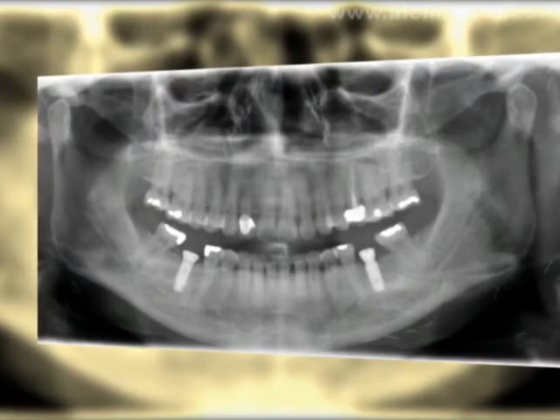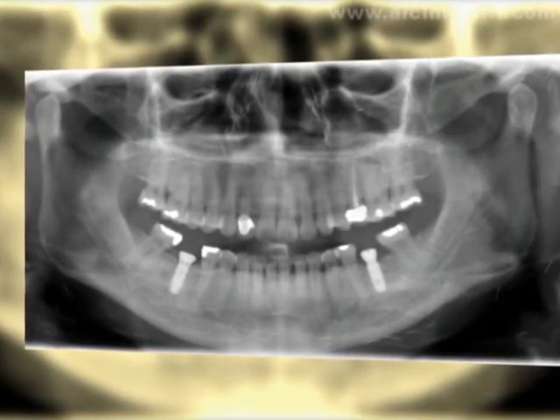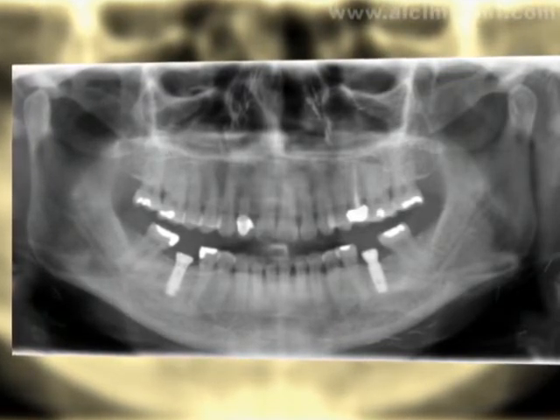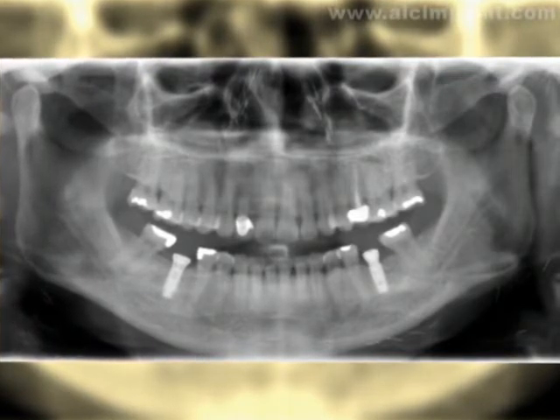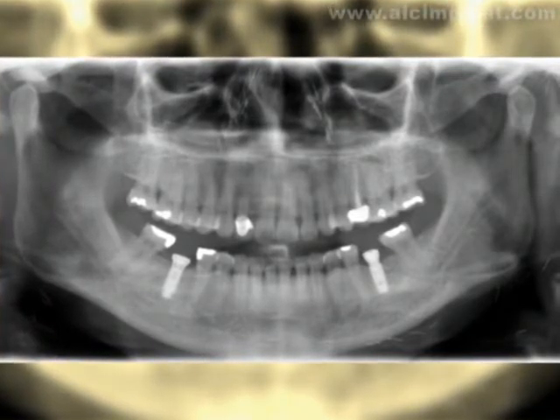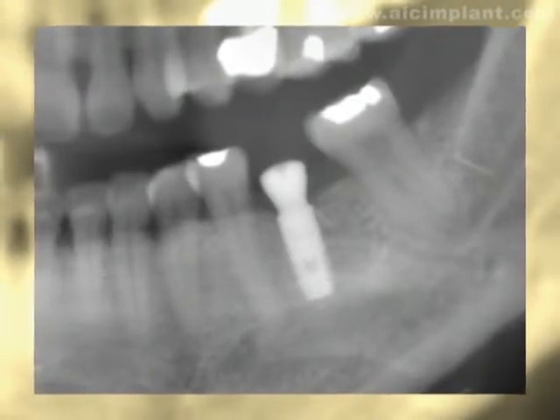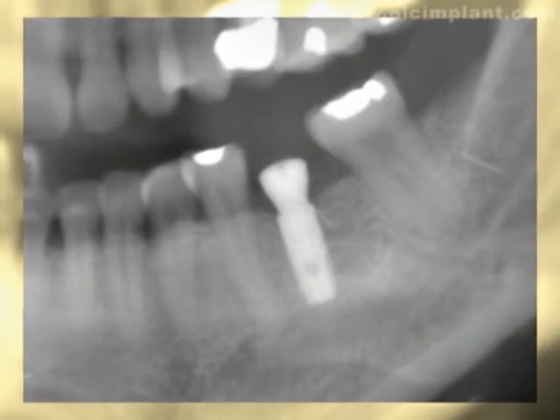These are the surgery results. A healing abutment was connected immediately after installing a GS2 implant on the mandibular left region. An SS2 implant with wide platform has been installed on the mandibular right region, considering the emergence profile. Since there were no difficulties in fixture fixation, impression taking will be done after 2 weeks.